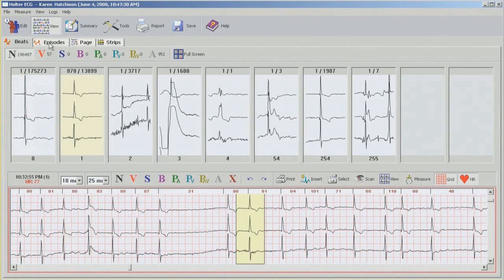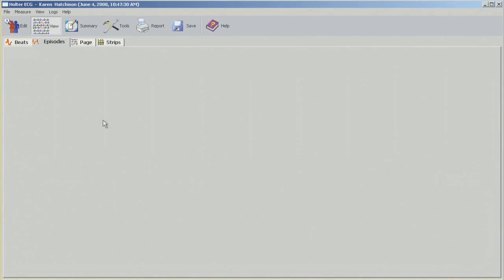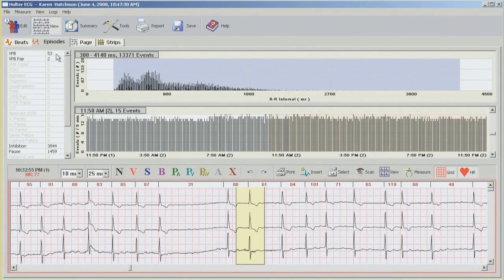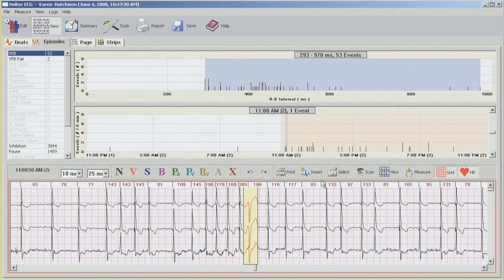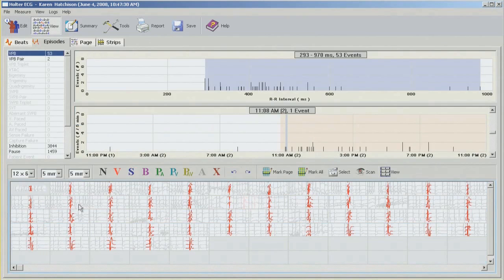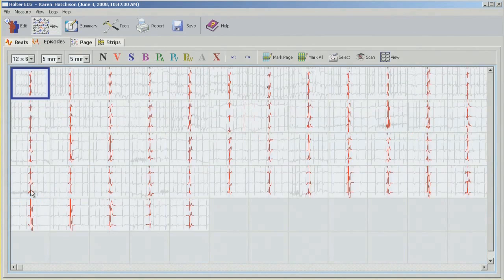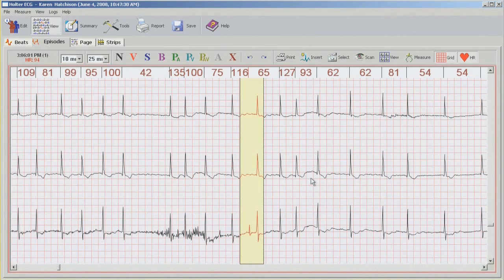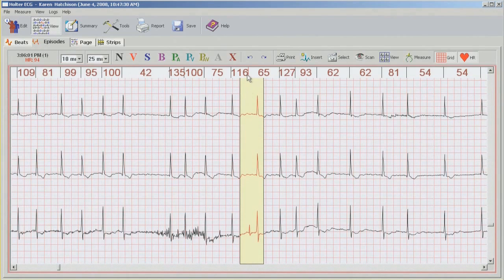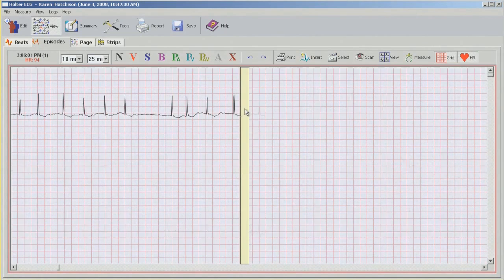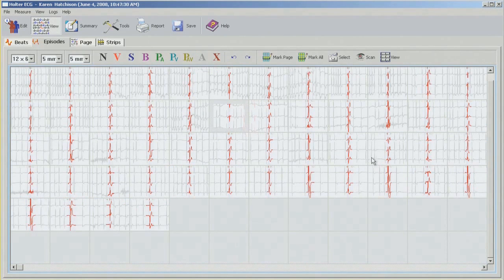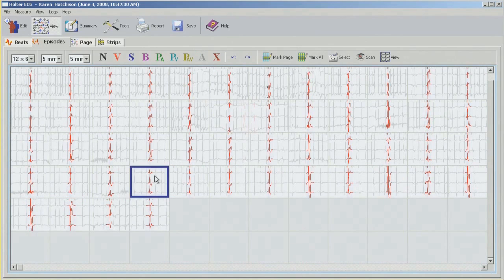And again, going into episodes mode. That leaves us with 53 ventricular beats and we have seen them already when we were editing through the ventricular bins. So I'm just going to quickly pull them up on the screen just to make sure we're not missing anything. And this one, sure enough, is a normal beat. So actually, it's not falling on the beat so I will change this to artifact. And everything else seems to be correct. So I'm going out of there.